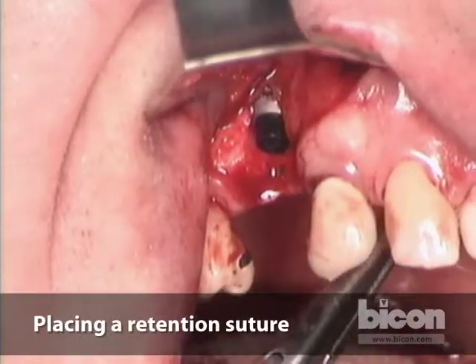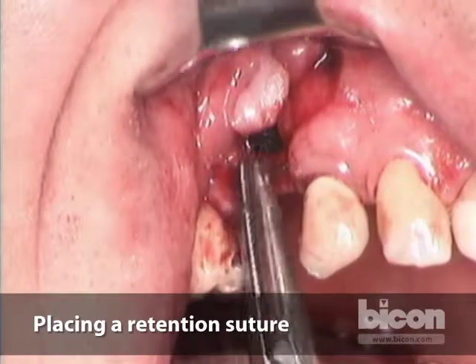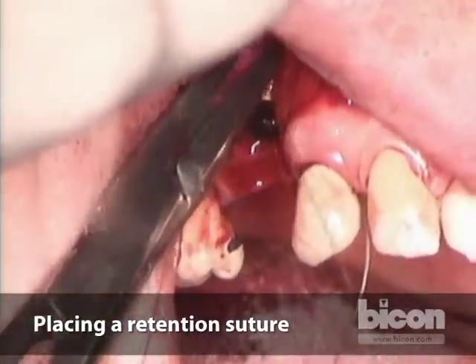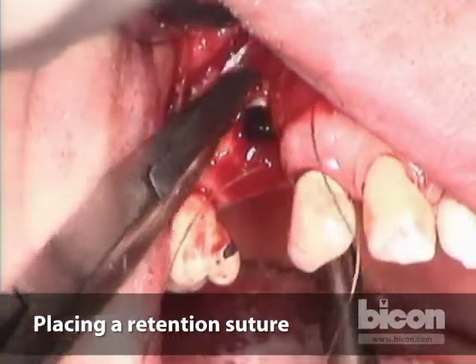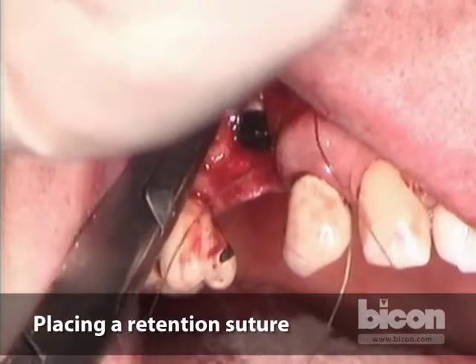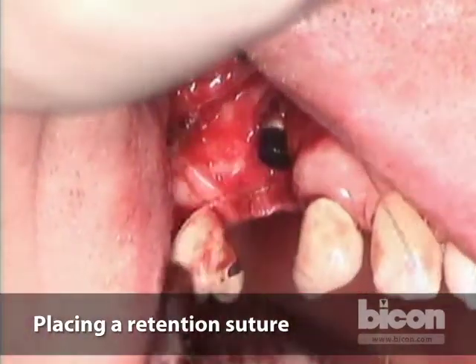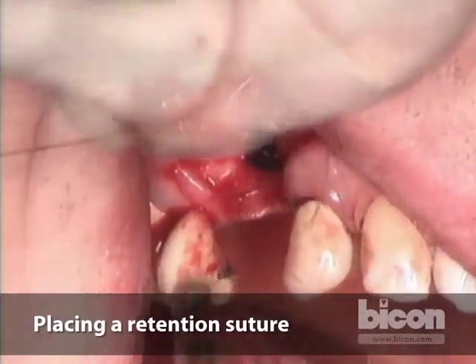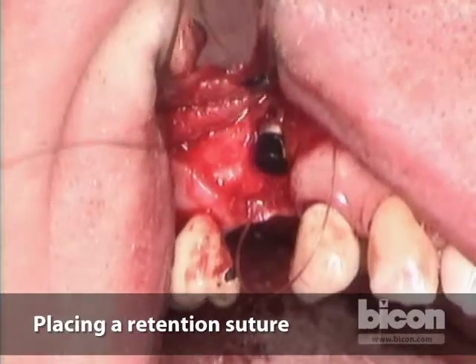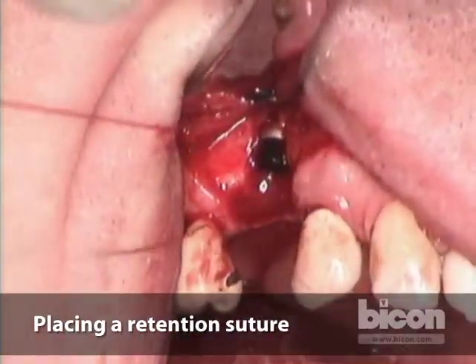Okay. Now we'll go ahead and place the retention suture. And the retention suture is sort of a means for us to stabilize the membrane right over the implant, so that it will not move and also will hold the graft. So now we will take another bite, and that will bring it out to the palate again.